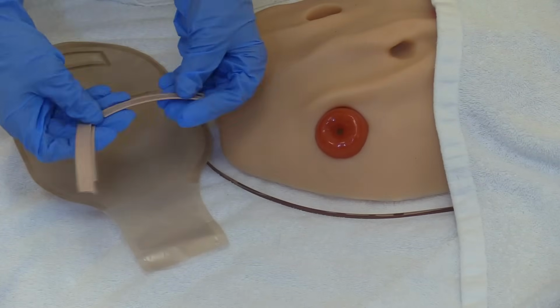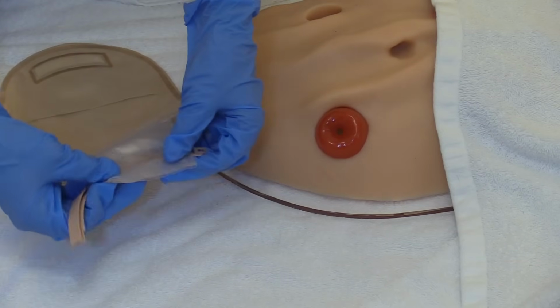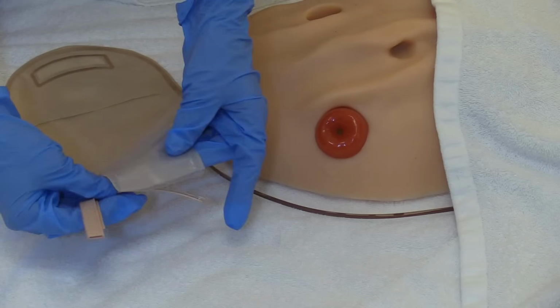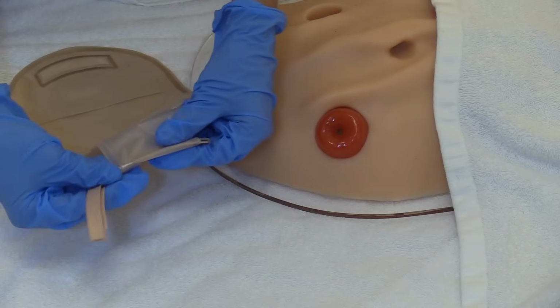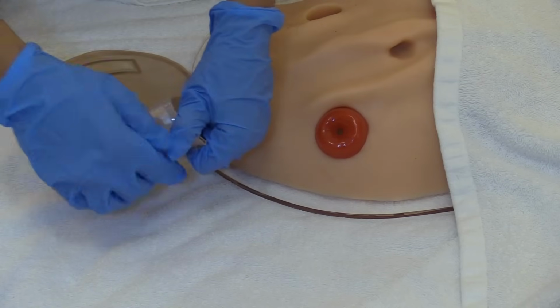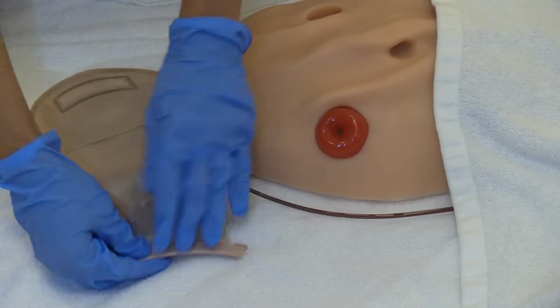So this is the clip. Like I said at the beginning, some Velcro. These clips can be a little bit cumbersome to use, so get familiar with how to use them. What you do is you take the end of the bag and you just simply fold it over the clip like so. And then you just press that down and it snaps in place. And you have your little clip on.